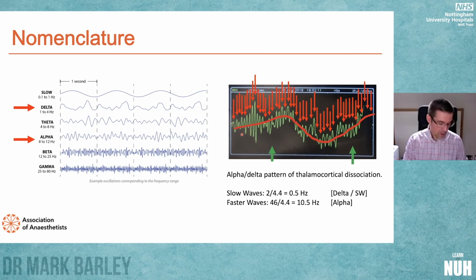Now, what I'd like to do over future sessions is build on this and get people familiar with looking at the raw EEG and interpreting it. But fairly soon there's going to be an update to the BIS monitor user interface, which is, to be fair, around about 15 years late in coming. And it's going to reintroduce some of the old features that they've had in the past.